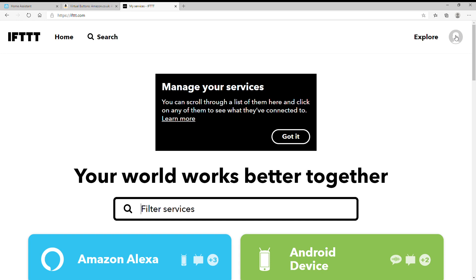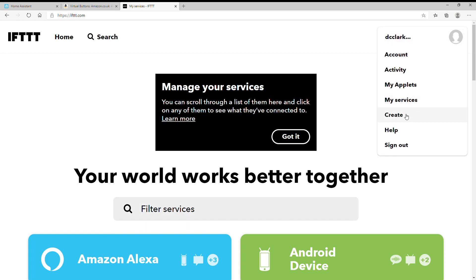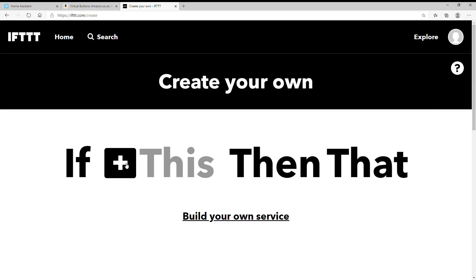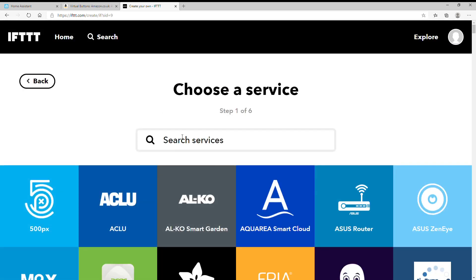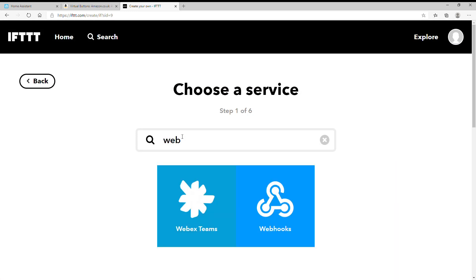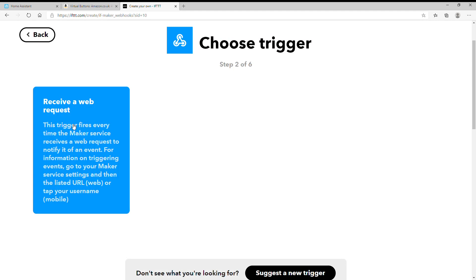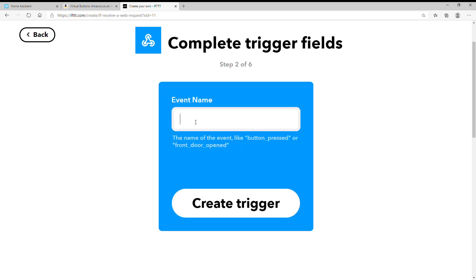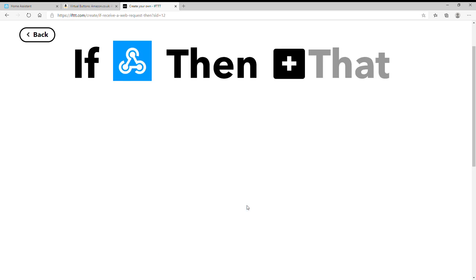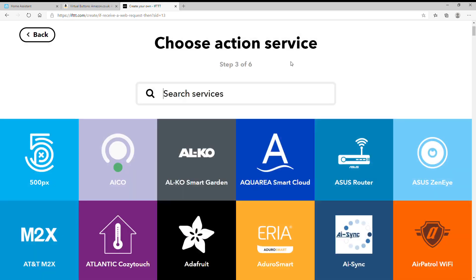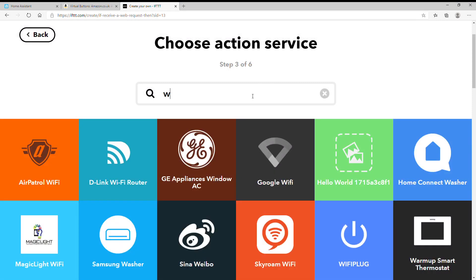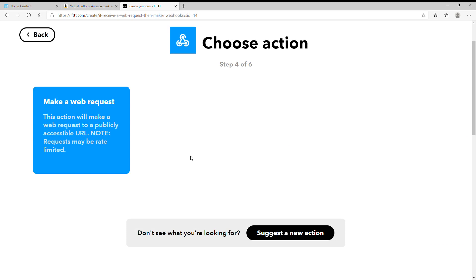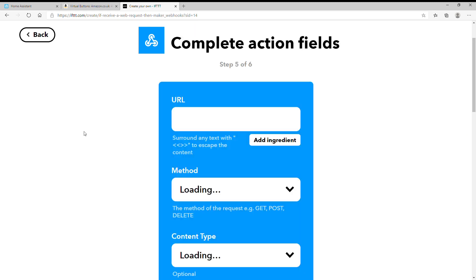It's going to trigger virtual buttons, so go to create, do 'if this', and search for webhooks — maker is now called webhooks. Select webhooks, then 'receive a web request'. The event name should be one of those four you wrote down. For this one, call it ns-urgent-low — it needs to be word for word exact, so copy and paste it. Create the trigger, and then for the 'that' side, this will also be a webhook because that's how virtual buttons works — make a web request.